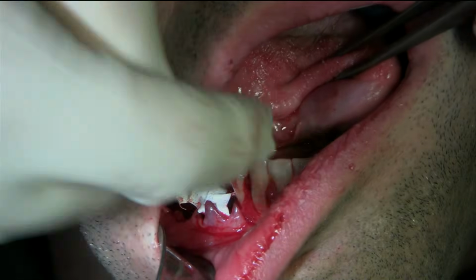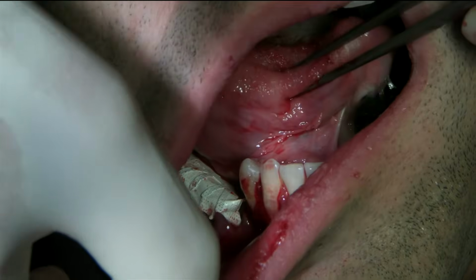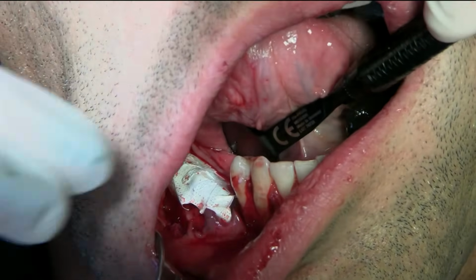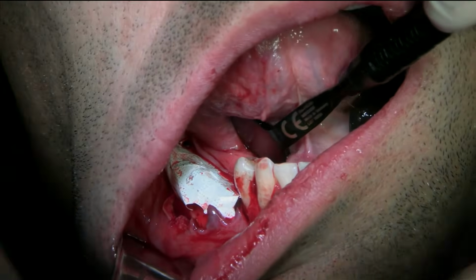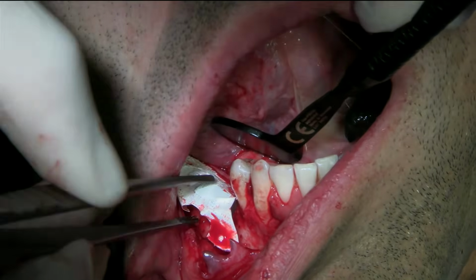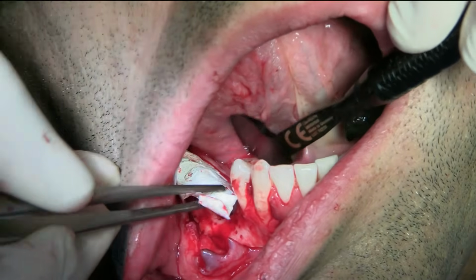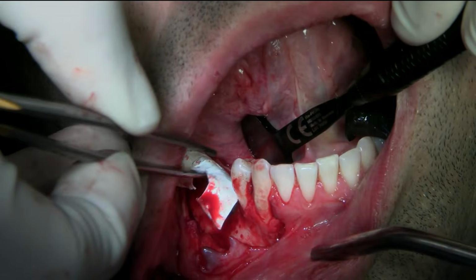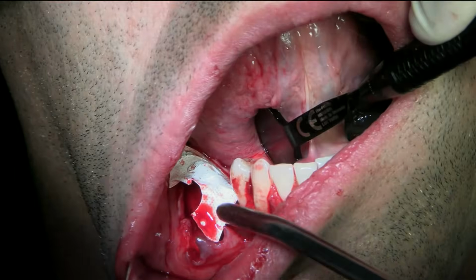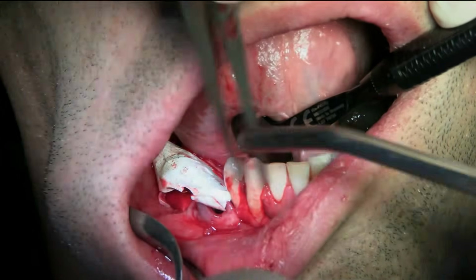Okay, good. So tongue, we track the tongue with the mirror. And then we're going to go here. If we're good, you have to hold here. Now let me see. Okay, I'm just checking if the membrane is stable. It looks to be stable, yeah. So now I'm opening the membrane so we can start placing the bone graft. Okay, hold on. Like that.